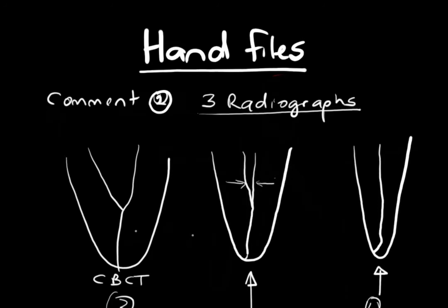But they could also, rather than going mesial with the cone, go distal. So literally just taking the cone of your normal X-ray unit, pointing it straight to the tooth, then moving it 20 degrees mesial and aiming it at the same tooth, then moving it back 20 degrees so it's straight on again, and then moving it forward 20 degrees so it's distal.